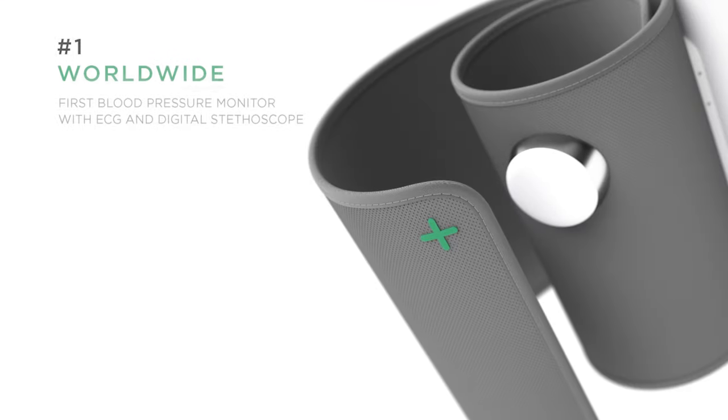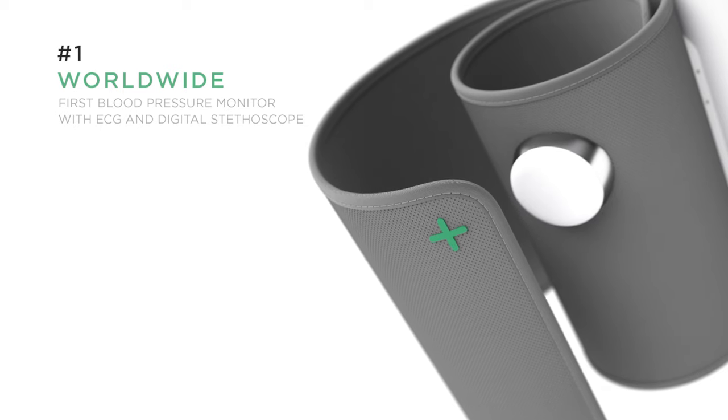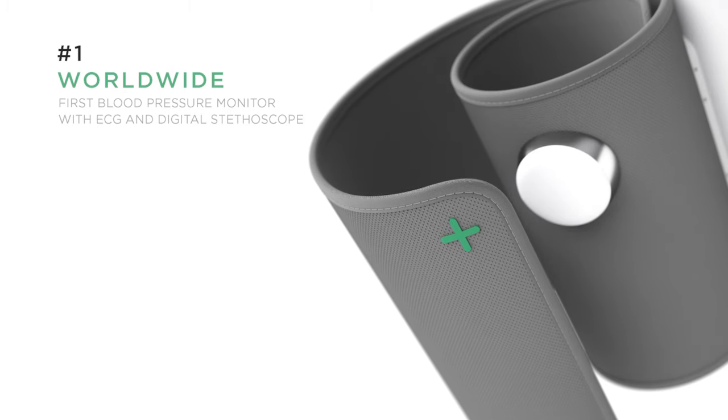Withings BPM Core is the world's first smart blood pressure monitor that can also help detect a variety of cardiovascular diseases that are more common among people with hypertension. And it does it all from the comfort of your home.